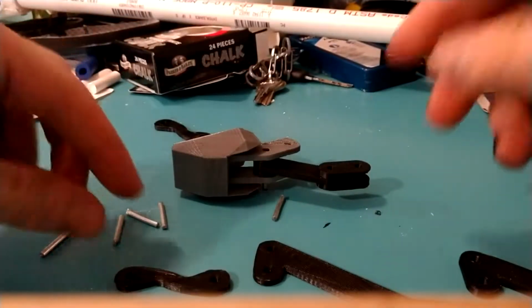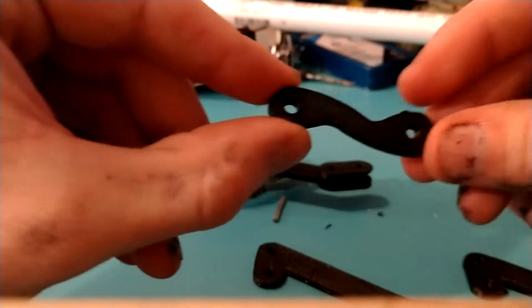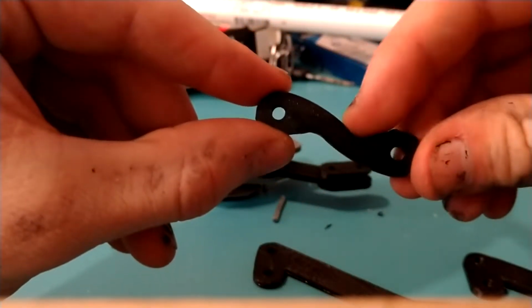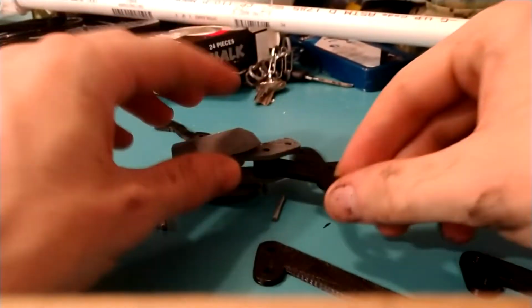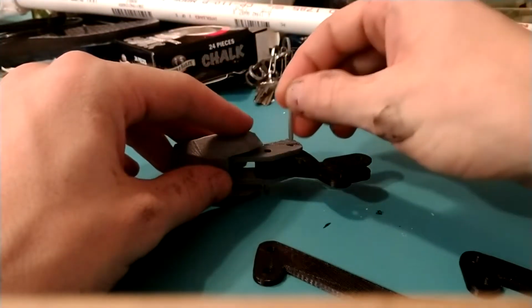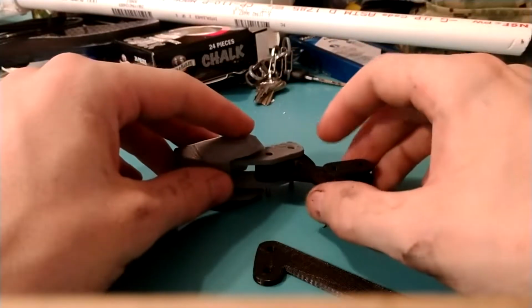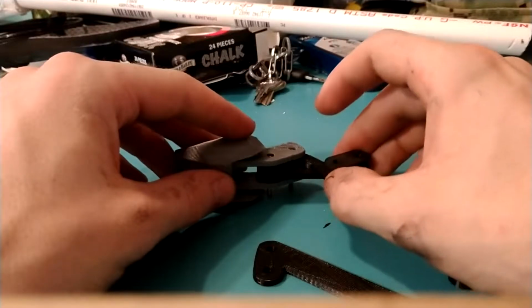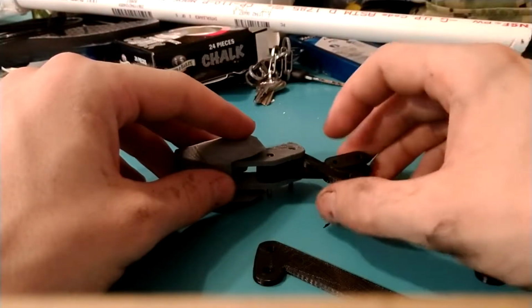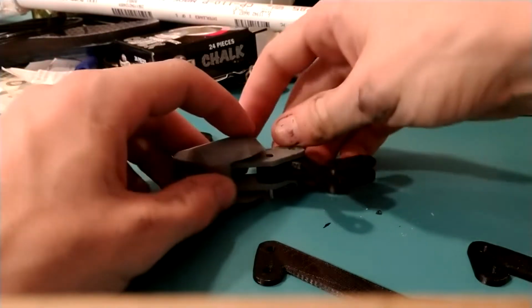Now, the next step is this piece right here. You want to make sure that you see how this part right here is a bit more caved in. Well, you're going to slide it in right through here. Pin that. Now, if you did it right, you should notice that this piece basically hugs the radius of this other piece. It's a little bit hard to see because they're black. Sorry about that.